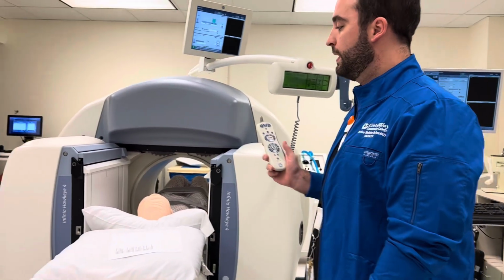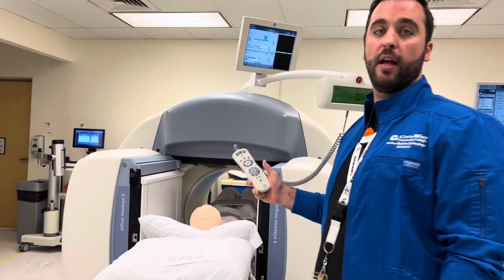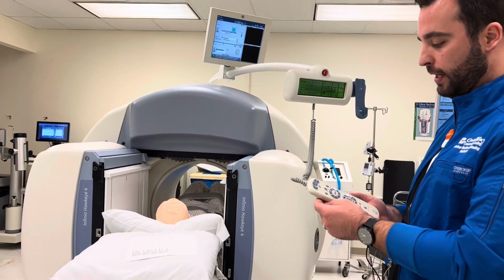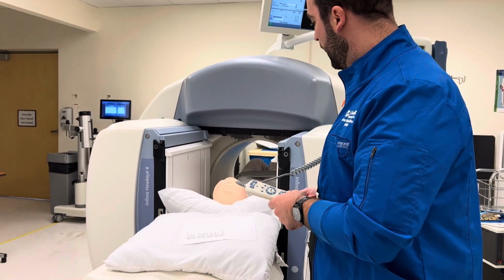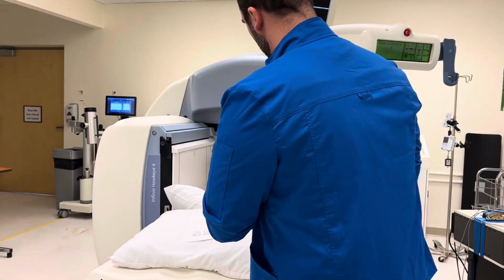So remember, with statics, the camera does not bring the detector heads all the way in. You have to manipulate the detector heads. So make sure they are as close as possible. Obviously in the lateral view you will have pillows in the way.